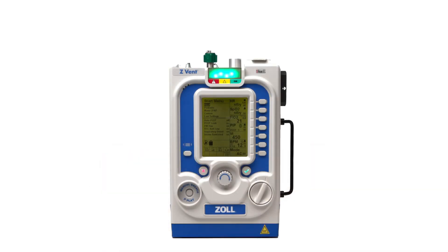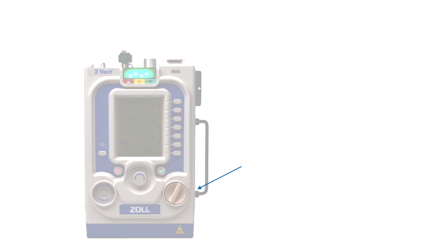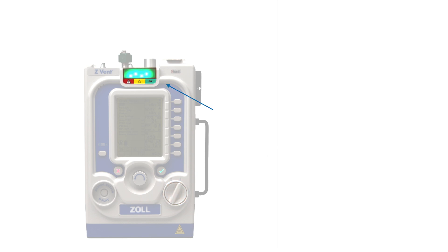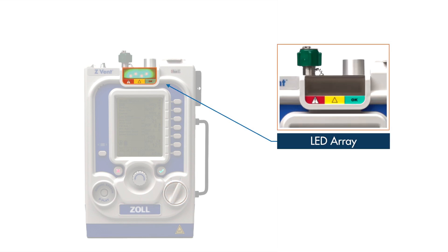Now we will look at the front panel of the device. In the lower right corner is the power switch. Simply turn the dial clockwise from 0 to 1 to power the device on and counterclockwise to power down. At the top is the LED array, which indicates the ventilator's operational status. In addition to audible alarms and on-screen prompts, the LEDs will change to yellow or red to alert the care provider of an error. The LEDs will turn green when no alarms or errors are present.